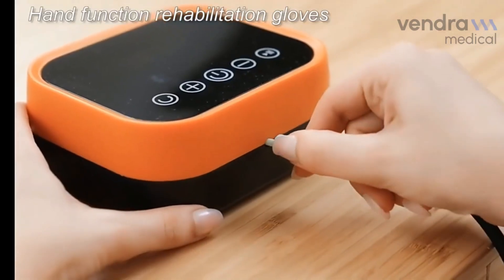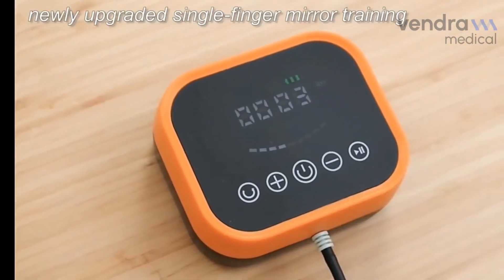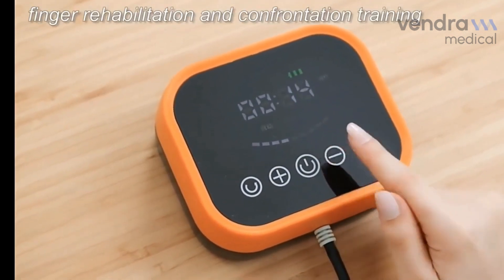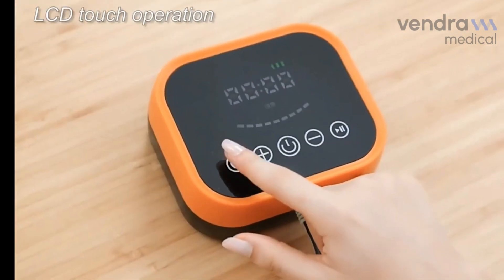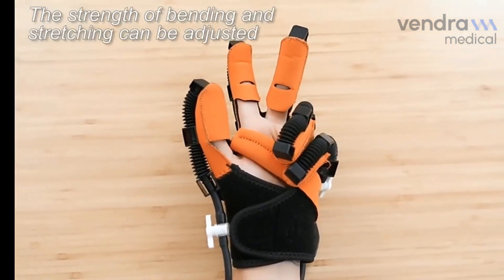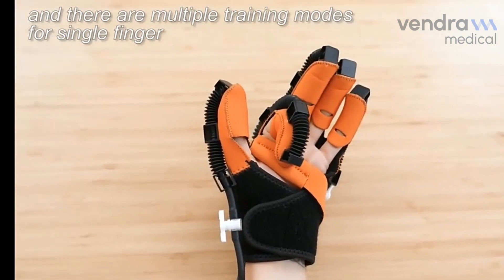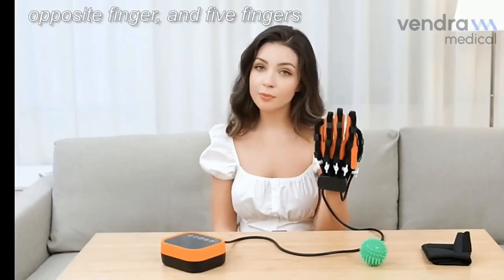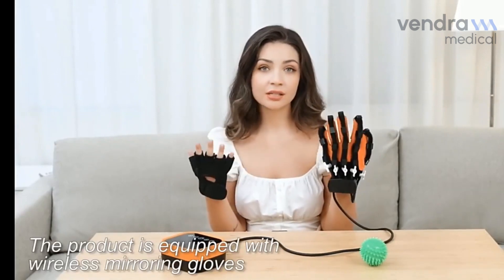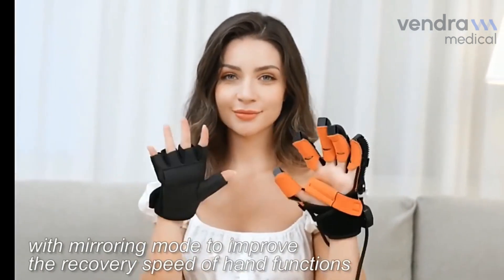Hand Function Rehabilitation Gloves offer multiple modes to cover rehabilitation needs, including newly upgraded single finger mirror training, finger rehabilitation and confrontation training. LCD touch operation allows straight-off bending and stretching to be adjusted. There are multiple training modes for single finger, opposite finger and five fingers. The product is equipped with wireless mirror gloves with mirroring mode to improve recovery speed of hand function.